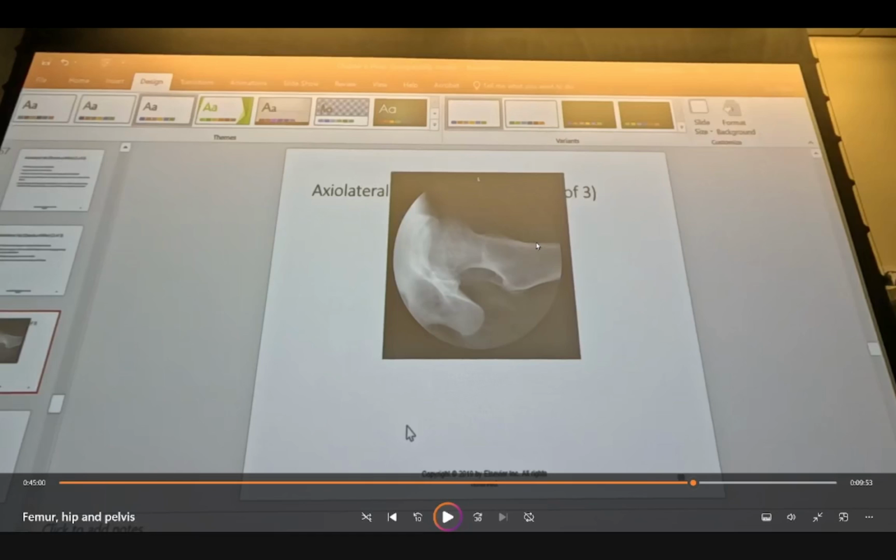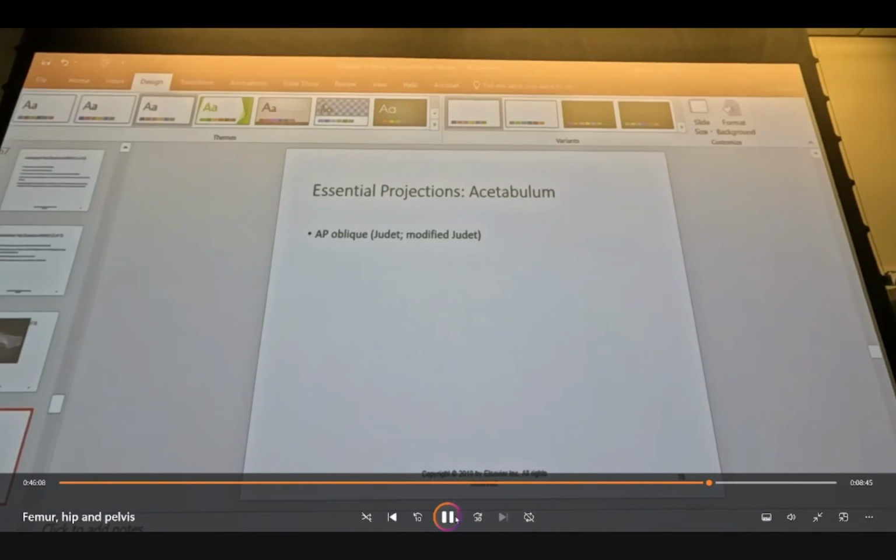So pelvic fractures. Pelvic fractures can be kind of dangerous because you've got the internal and external iliacs running directly in front of the iliac wings. So good imaging of the pelvis and pelvic fractures is kind of difficult. We talked about the AP. Let's say we shot AP, and we noticed the patient had what we refer to as a vertical shear fracture or possibly anterior pelvic bone fractures. How are we going to image those in different planes? The Judet method is one of the ways that we can do that.